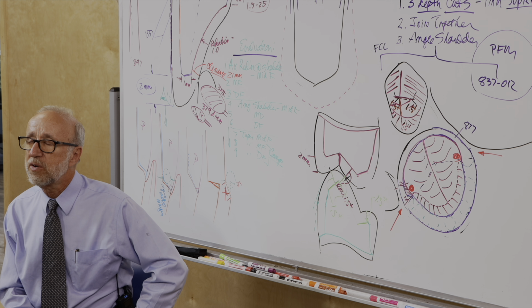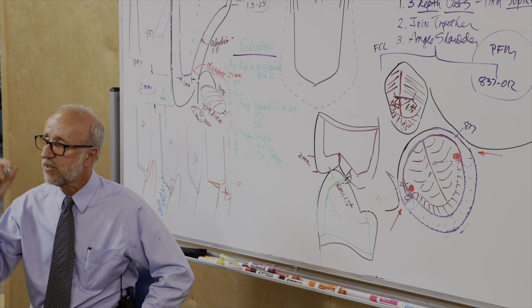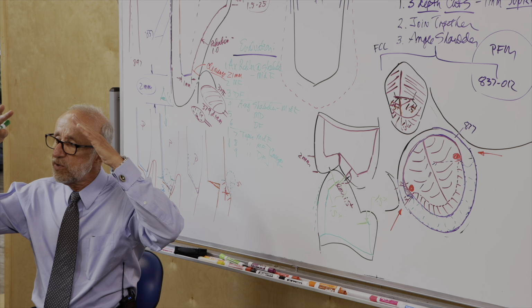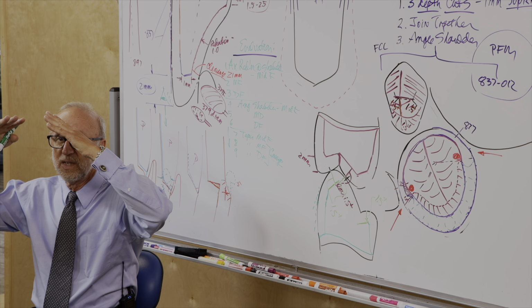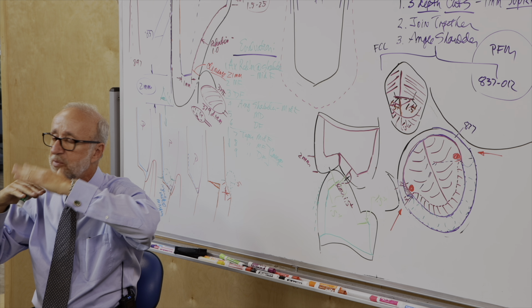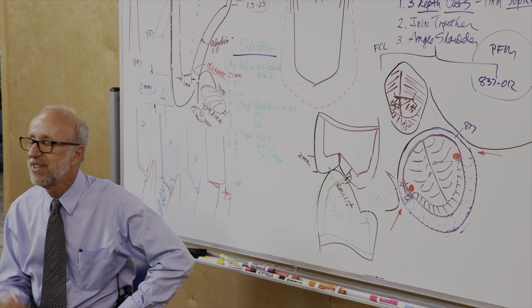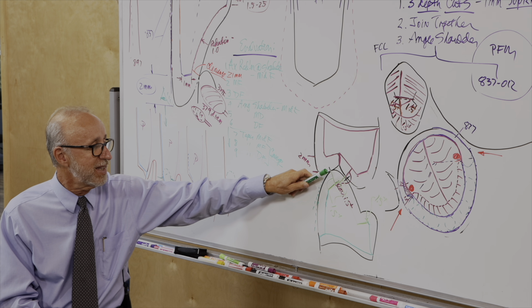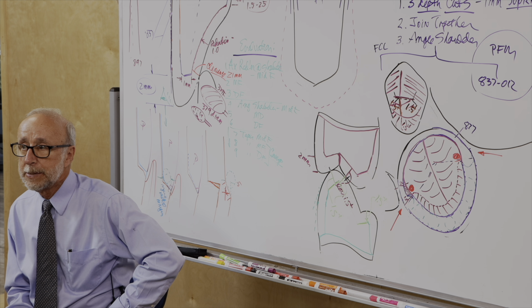Okay, so there's a lot more tolerance when it comes to ceramic crowns as far as the thickness. We want to make sure you have plenty of thickness. On a short tooth, we're careful not to over-reduce, because if we did 2 millimeters clearance, then we probably have really short little preps, depending upon the type of tooth we have, and that looks unrealistic. It just looks awkward. So we're going to try to be fairly conservative, but still get at least a full 1.5 millimeter clearance in each of these areas I talked about. Okay?